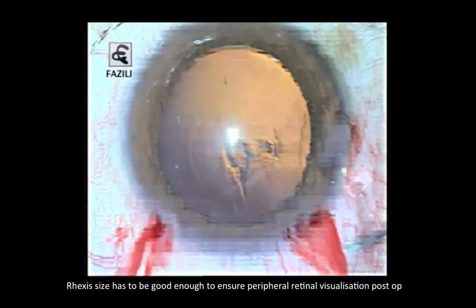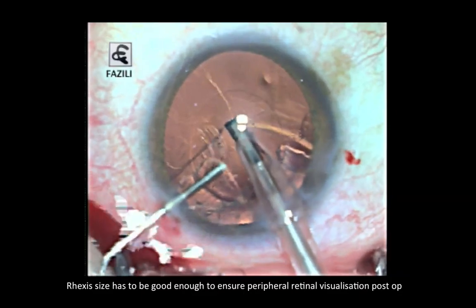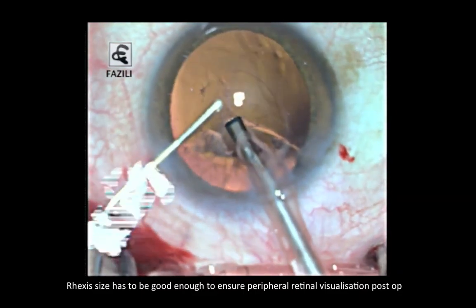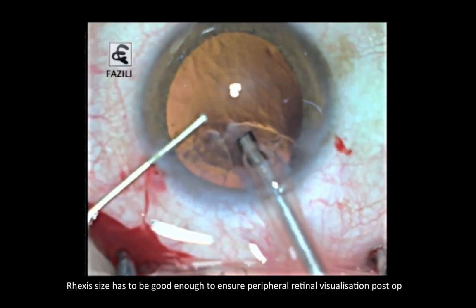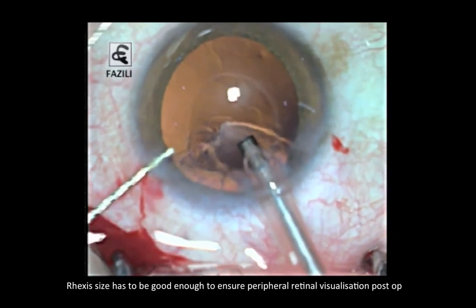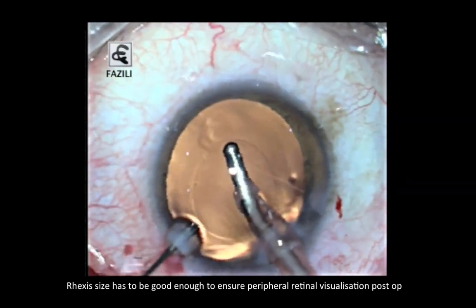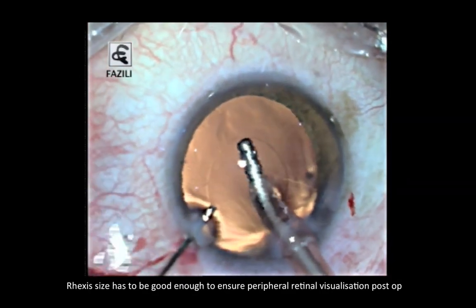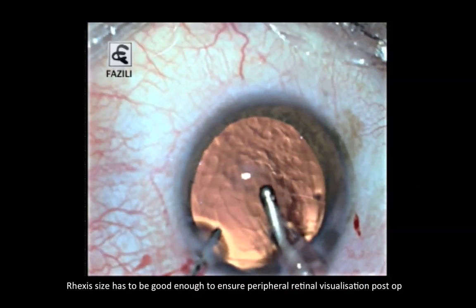So a repeated dilated fundus examination is indicated to search for any possible retinal breaks or weaknesses that may have been created during the surgery. For that, it's very important to remember that the rexis size has to be good enough to ensure peripheral retinal visualization post-op. Same precautions. You can see the rexis size is slightly smallish. You've been able to do a phaco, and before you take out the probe, you inject some viscoelastic. Then you do an IA, and at the end of the IA, before you remove the IA probe, you put in a viscoelastic and inflate the chamber.